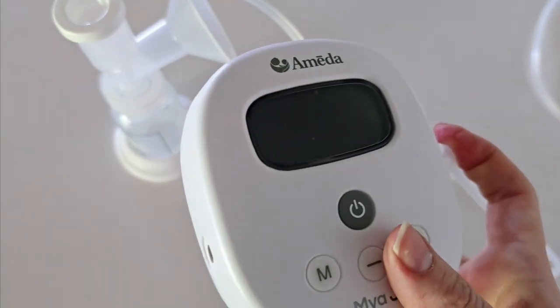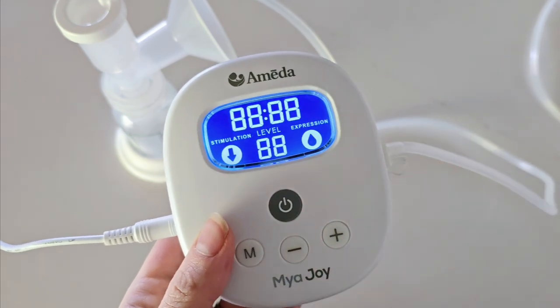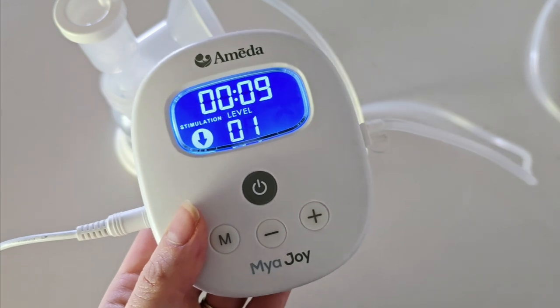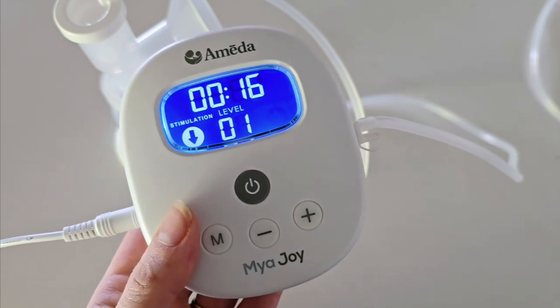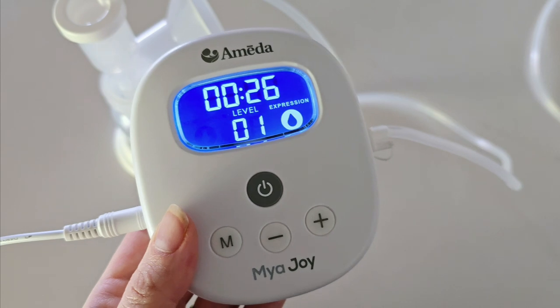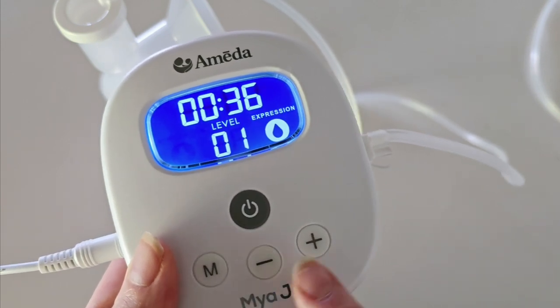To turn the pump on using the plug-in adapter, simply press the power button. Your pump has two modes: stimulation mode, which uses short suctions to initiate your letdown — run this for around two minutes or until your milk flow comes in. Once your milk flow comes in, press M to switch over to expression mode. The pump will automatically transfer to expression mode after two minutes if you forget.